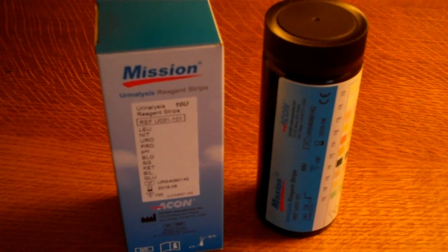The test includes 10 different parameters including leukocytes or white cells, nitrite, urobilinogen, protein, pH, blood, specific gravity, ketones, bilirubin, and glucose.